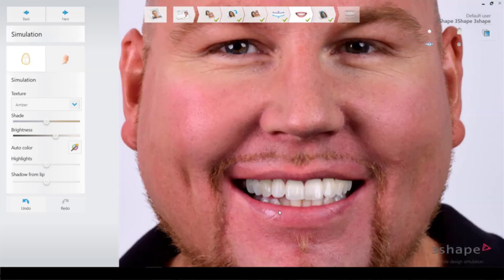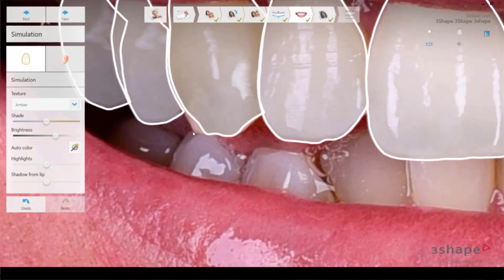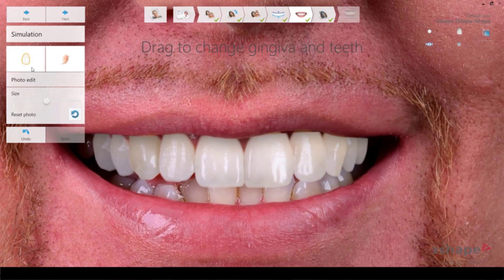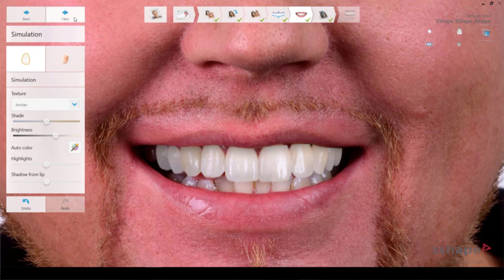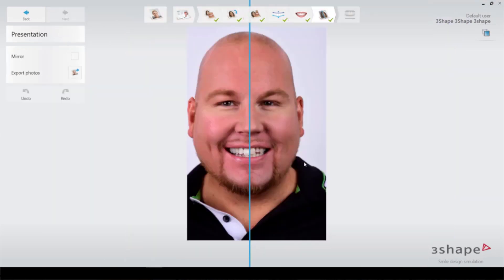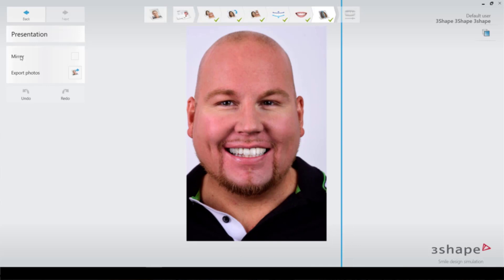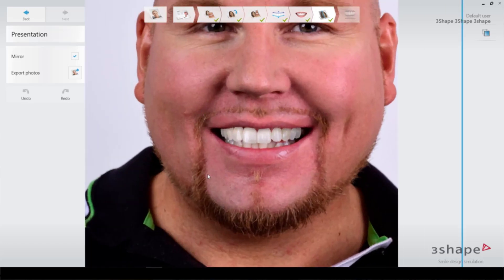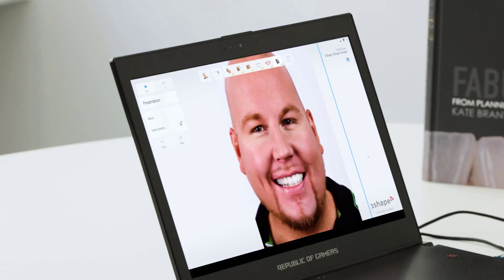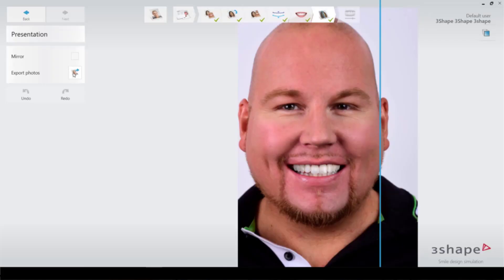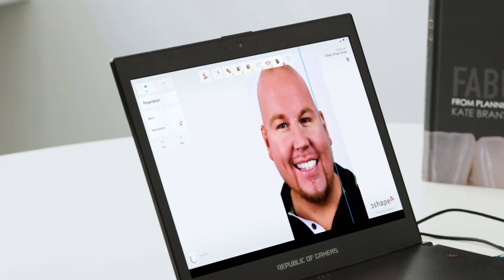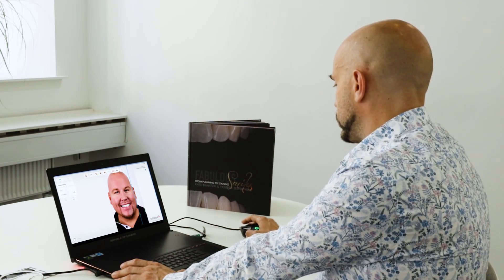We can also see that the canine is pointing out a little bit, and we can move it just like this so it comes behind and won't show anymore. In the final step, where we show this to the patient, there's a new mirror feature — this is basically how the patient looks at themselves in a mirror. We can check if it looks good and balanced, then show the patient the smile design. We have an option to export the photos, and I'll export them here to import them into the dental system. That's basically it from the Three Shape Smile Design simulation.